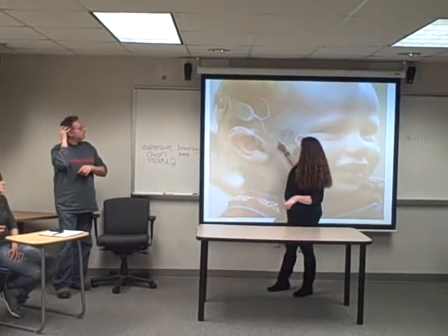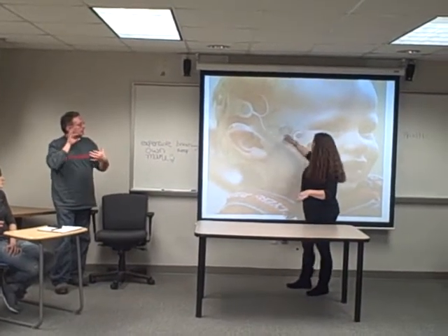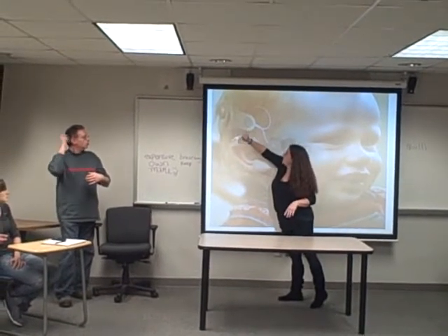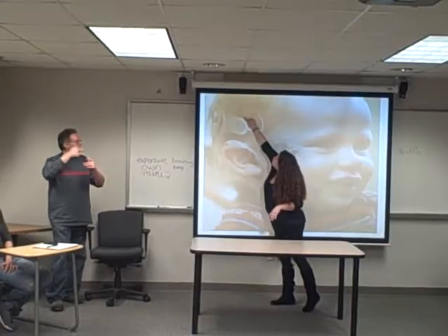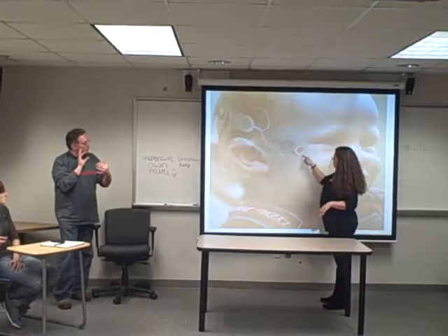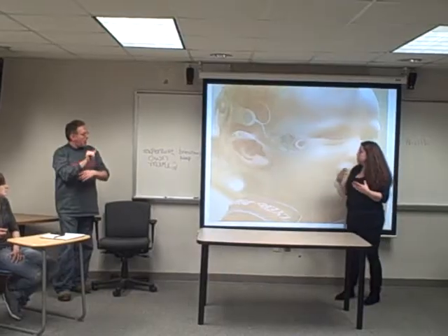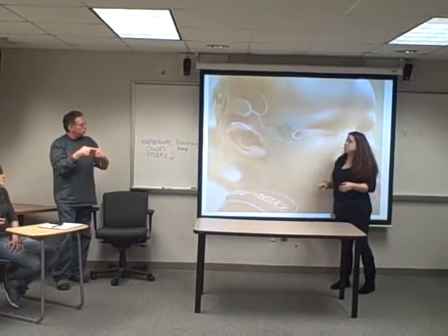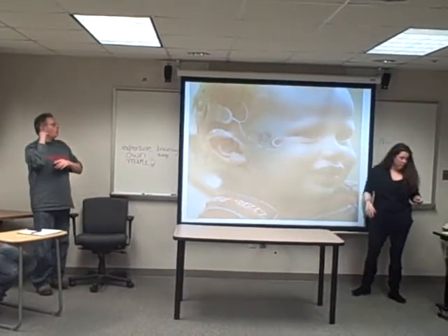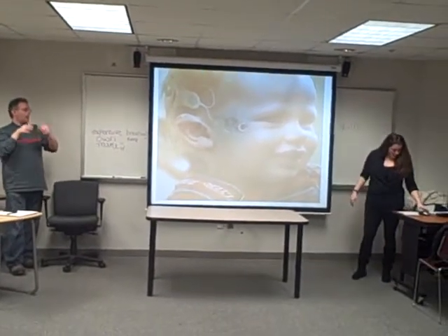And then there are 2 rubbery threads that finish off the job, basically. The sound comes up through the coil, the external magnet transfers it to the internal magnet, which then brings the sound down this thread, and it meets with this thread. During the surgery, this thread is threaded through the cochlea and it takes the place of the cilia and the electrodes. So instead of sound vibrations, it turns it immediately into electronic stimulation and sends it to the auditory nerve and into the brain. And it's instantaneous hearing, it's not a delayed hearing.